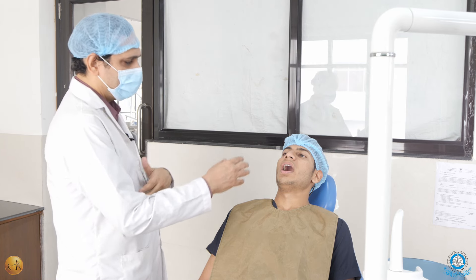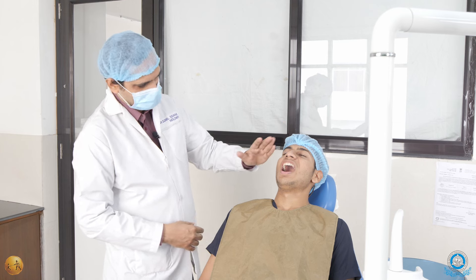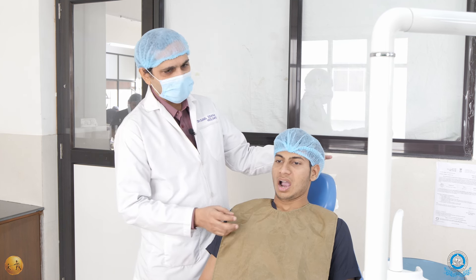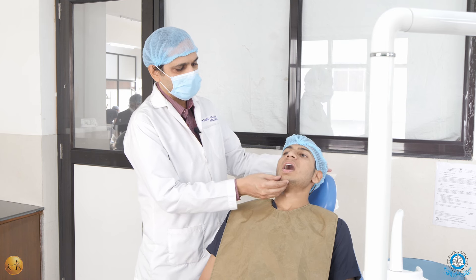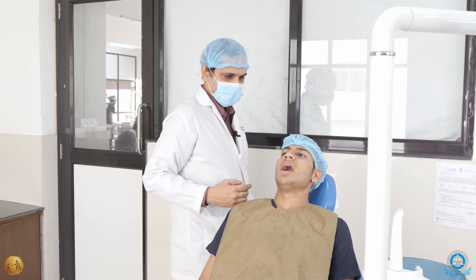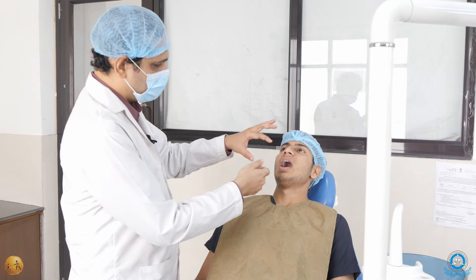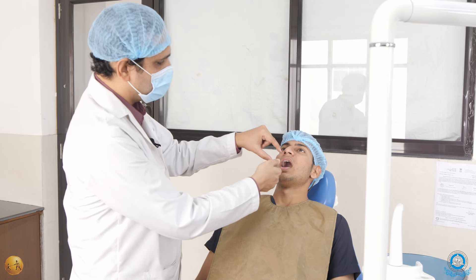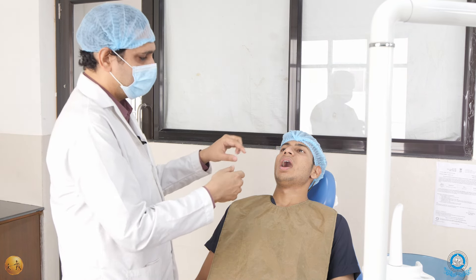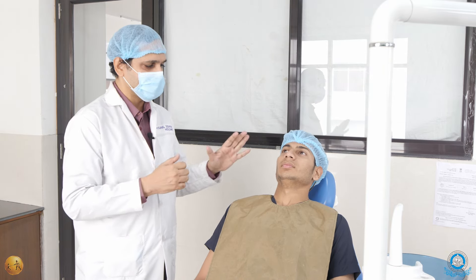It should not be very low or too high. As you can see, the occlusal plane is at 45 degrees to the floor — it should not be bent down, it should not be like this. It should be at 45 degrees to the floor. I am just raising the chair so that it should be comfortable, so that you should be standing upright and able to do the extraction for the upper arch. Never bend down, so that it should be comfortable for you. That's it about the maxillary extractions and patient position.